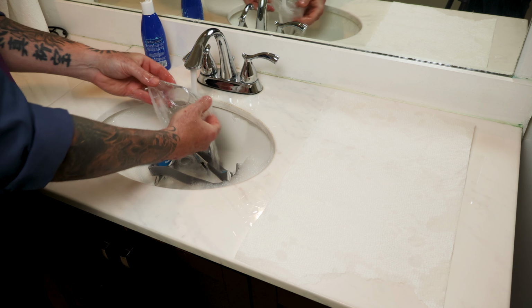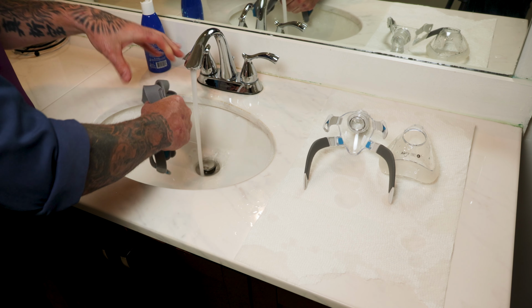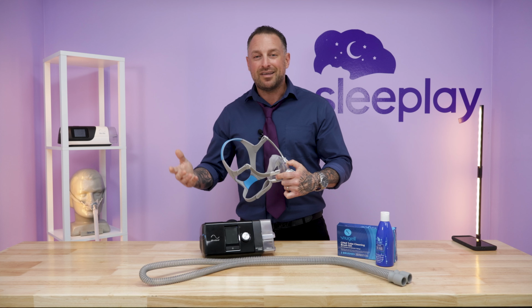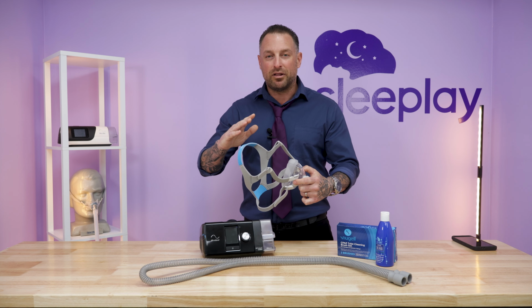First thing is the mask. The mask consists of three parts. You have the headgear, the frame, and the cushion. Now what I like to do is separate them all so you can get a good, thorough cleaning. So you take the headgear off the frame, you take the cushion out of the frame. You're going to clean all three of those in that warm soapy water, mild soap. Remember, you want nothing too harsh. You don't want to have to smell the scents afterwards and breathe that stuff in. And so you'll clean those out nicely. You're going to place them on the clean, dry towel to let them air dry. If you'd like to, you can wipe them down as well.